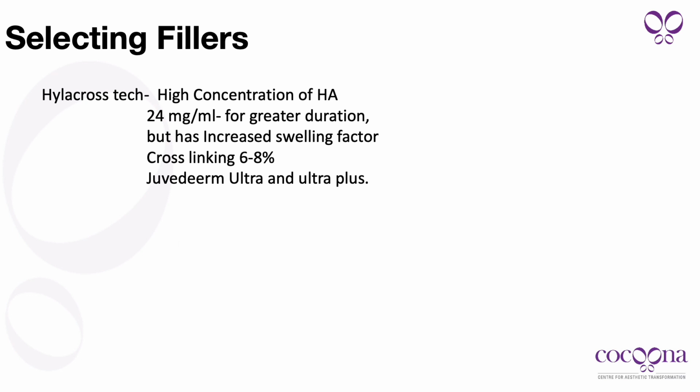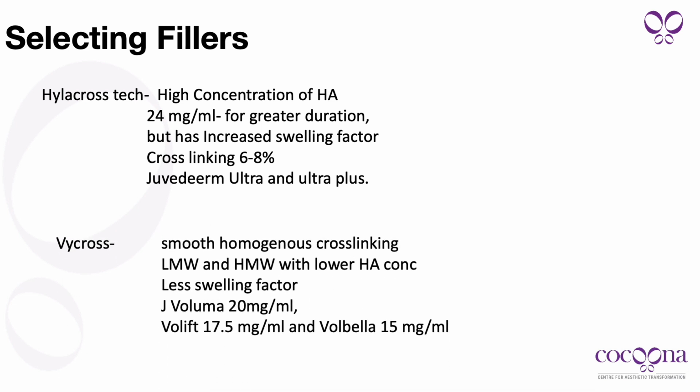Then remember the cross-linking mechanism. The Hylacross technique, for example, uses higher concentration of hyaluronic acid but has more cross-linking, 6 to 8%. Therefore, although it lasts longer, it has more swelling capacity. So if you want to use volume and are not worried about the swelling factor, then Hylacross technique fillers are good. Whereas Vycross techniques are smooth and homogeneous with a low molecular weight and high molecular weight combination, have less swelling factor, and can be safely used in the majority of the indications.